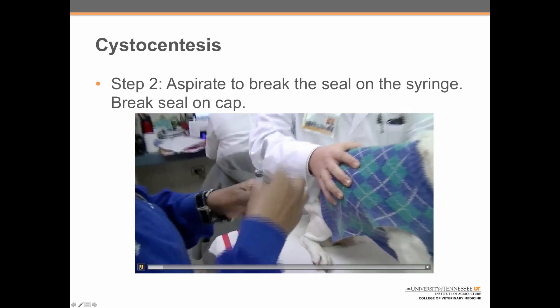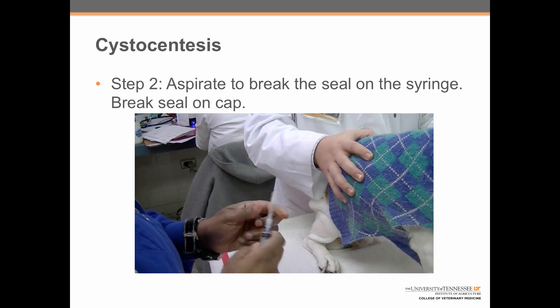Step two: aspirate to break the seal on the syringe. Also break the seal on the cap and set it aside.